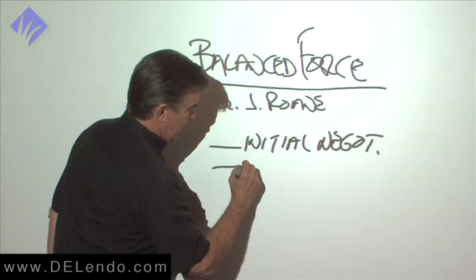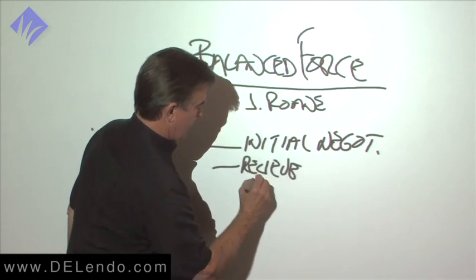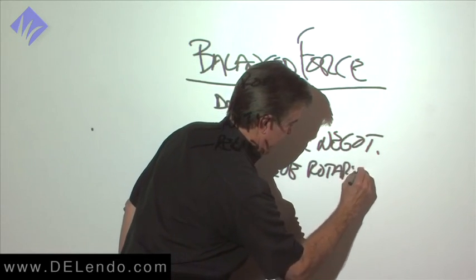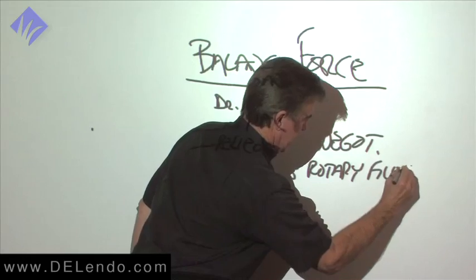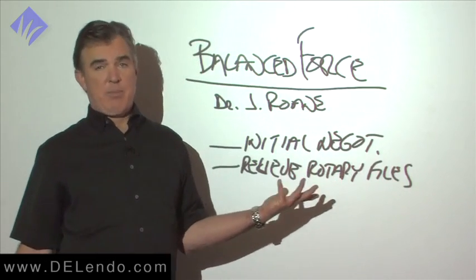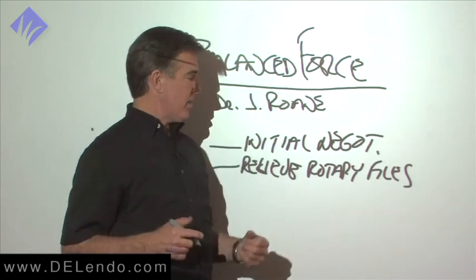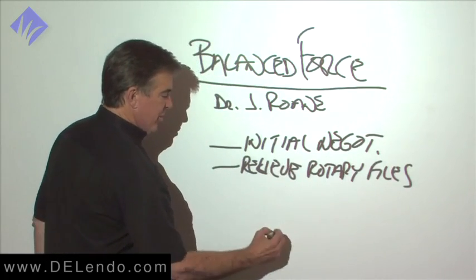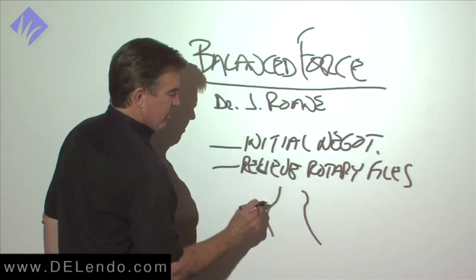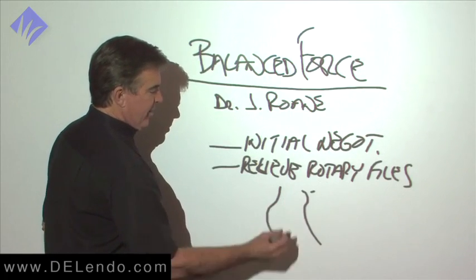This is to relieve rotary files. Okay. Nobody ever said rotary files can shape any root canal. They can't shape every root canal. The more clever we get, the greater range of anatomy we can use these in, but when you start having S curves like that, especially those that get really tight at the end, your rotary files are going to be just fine until about here. They're going to hang up.